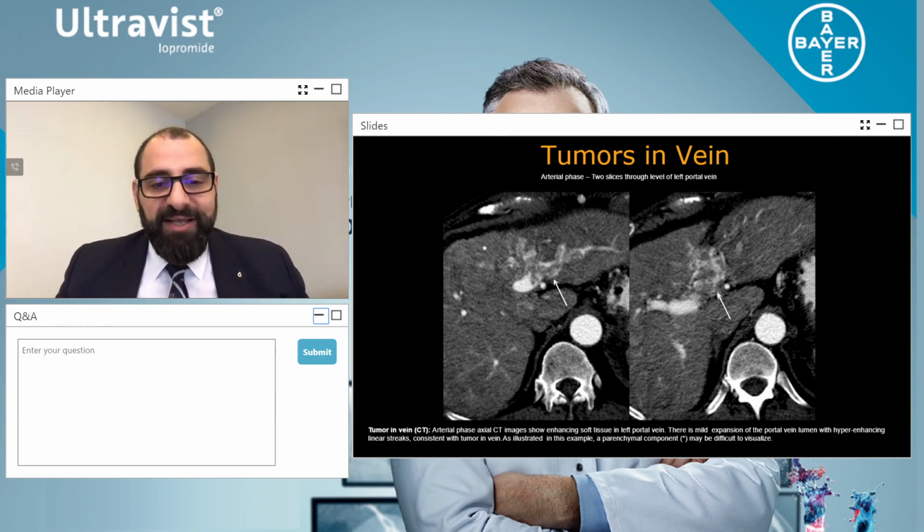But let's have a look at the scan between the left and the right. In actual fact, the image on the right is a lot better than the image on the left, and I'll tell you why. The image on the left shows a tumor in the portal vein, which we can see with the arrow. But as the contrast is trying to get through, it looks a lot better because it has gone through, but you have a perfusion deficit within the liver. Whereas if you look at the image on the right, even though the contrast has gone through, look at the difference in perfusion deficit.